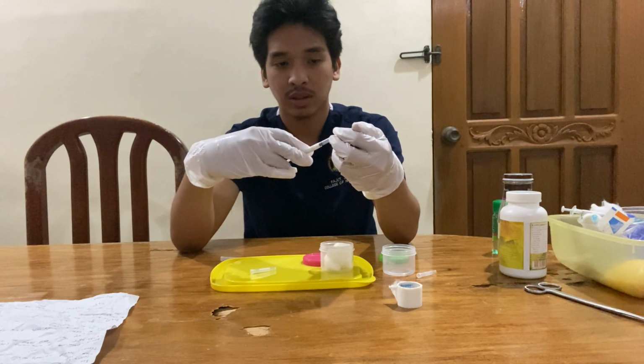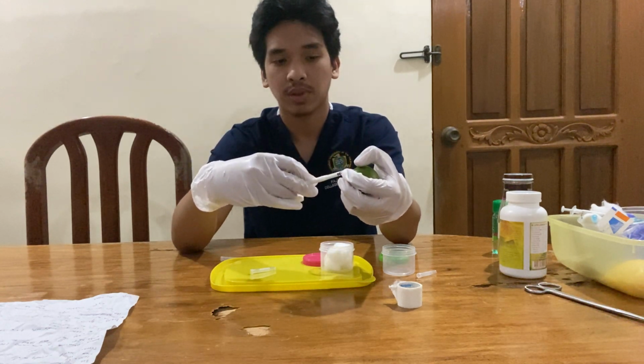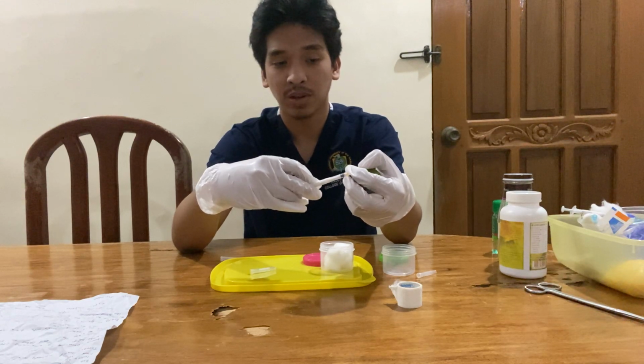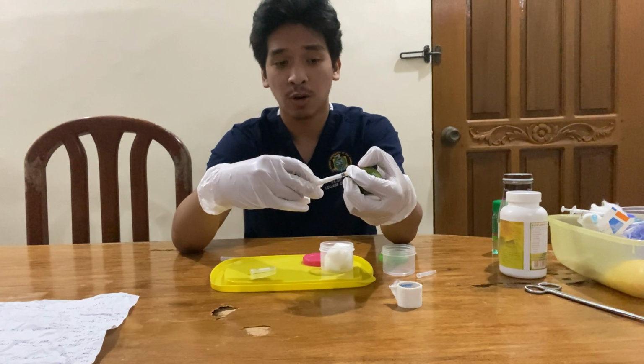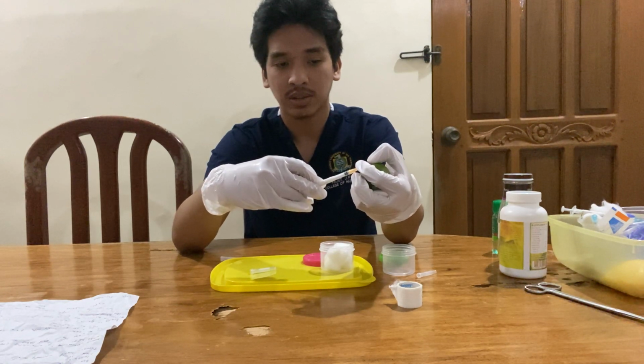Okay, once it forms a bleb, wait for 5 to 10 seconds and slowly remove the needle.